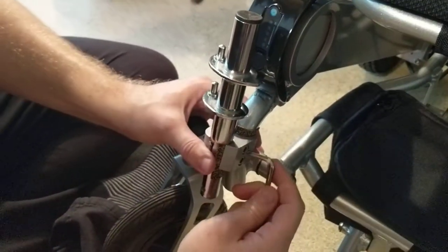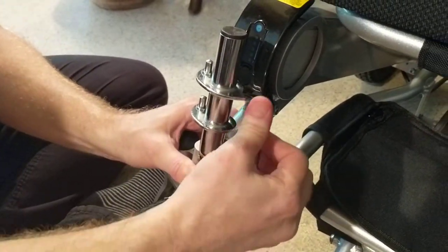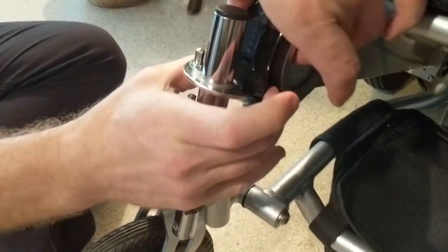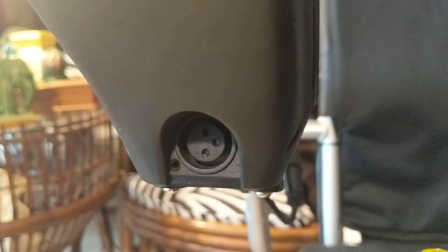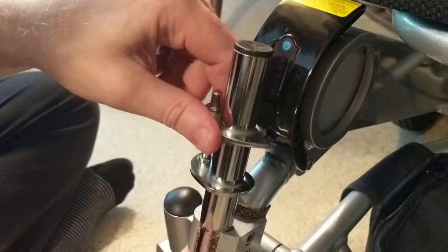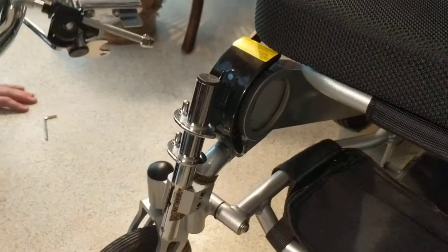Now that we're getting this nice and tight onto the chair, note that the battery itself doesn't come out. Looking at the joystick, the front of the joystick charges both of the batteries. You're going to plug the battery charger in right into the joystick. We can leave these here when the chair folds up.